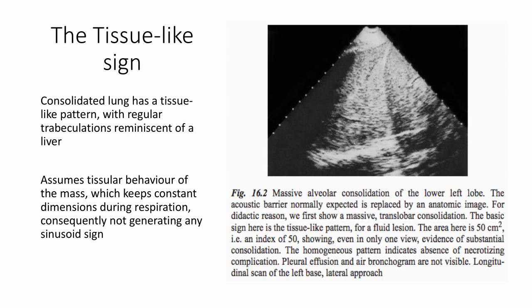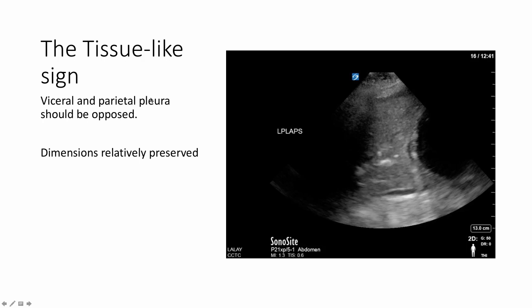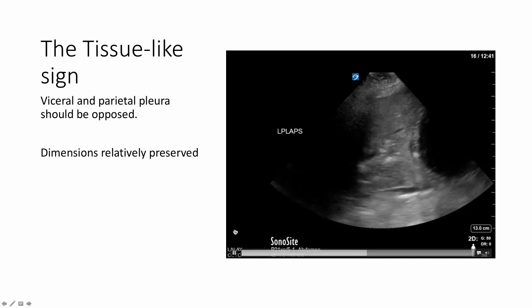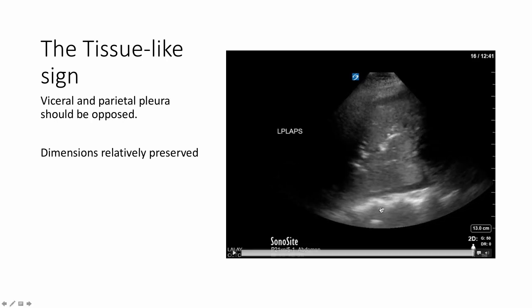Here we have the tissue-like sign represented pictorially. The lung parenchyma looks awfully similar to the liver parenchyma, and it assumes the pattern on ultrasound of the liver. Notice, though, that lung dimensions are maintained. You're seeing evidence that there's lung all the way out from the diaphragm to the anterior and posterior chest wall. You are also not seeing any pleural effusion. An example of the tissue-like sign taken from our ICU here — this is the left PLAPS view. We can appreciate spleen over here, and this is the lung with the anterior chest wall, diaphragm, posterior chest wall. Notice the maintenance of lung dimension. There are some air bronchograms here and very minimal pleural effusion. The lung architecture here or echogenicity looks very similar to what we would expect on scan of the liver.